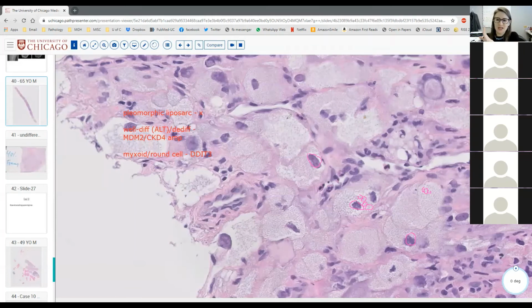So by definition, a lipoblast, regardless of whether it's a signet ring, where the nucleus is indented on one side, pushed over by the fat vacuole, or whether your lipoblast is bivacuolated, in either case it's going to squash the nucleus: on one side if it's signet ring, on two sides if it's bivacuolated, and if it's a pleomorphic lipoblast, on multiple sides by the multiple fat vacuoles.